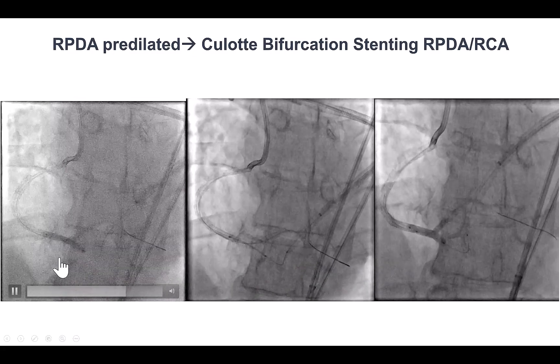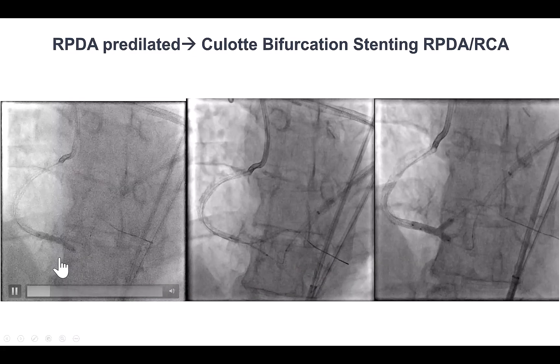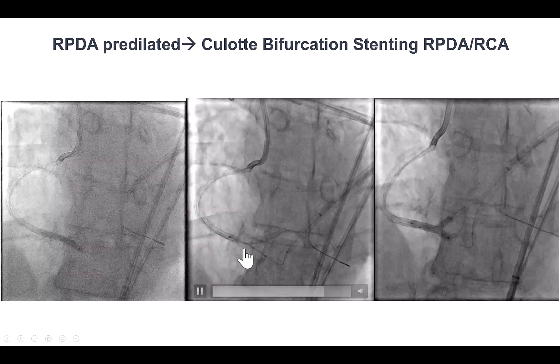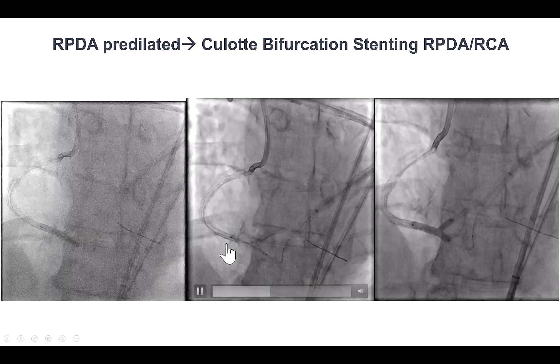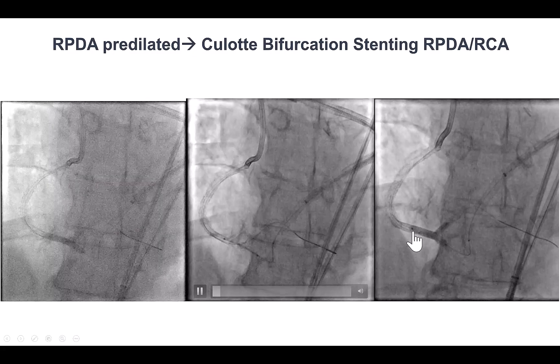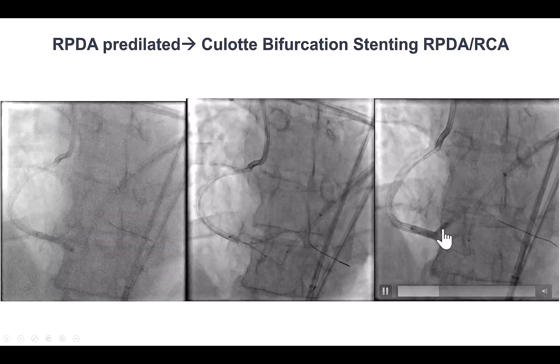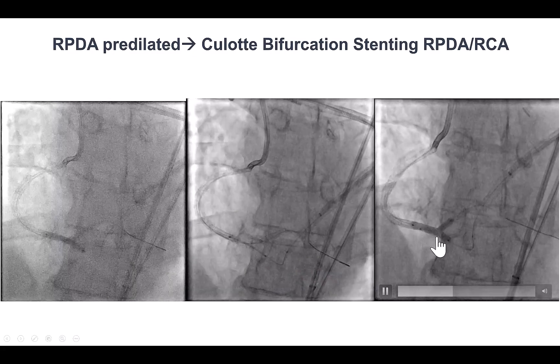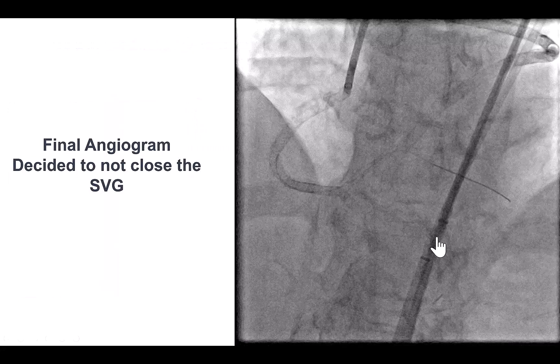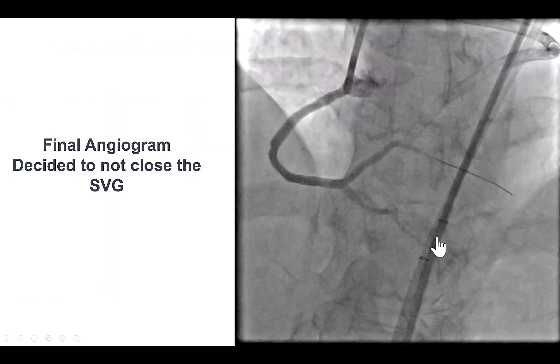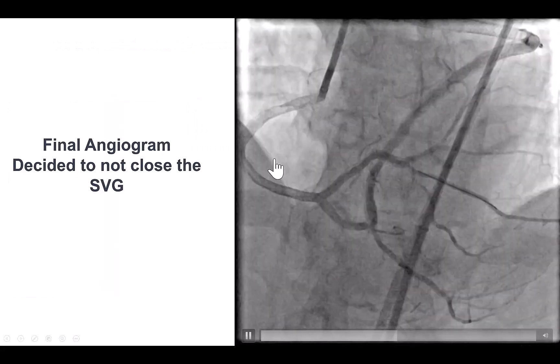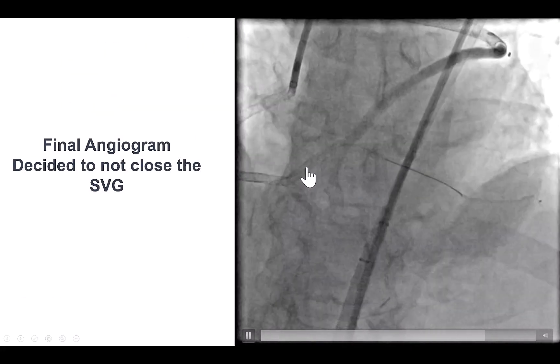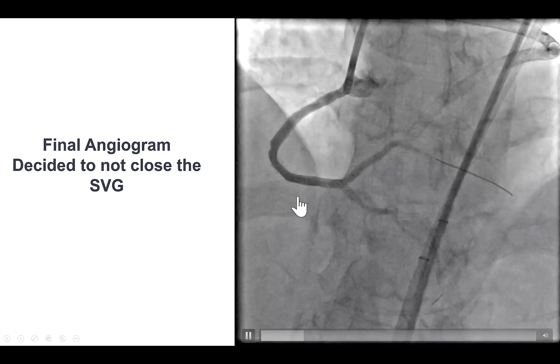We knew we had the PK papyrus, so we wanted to put a second stent. A stent was placed from the distal RCA into the PDA, followed by kissing balloon inflation. The final result showed good flow both into the posterolateral and the PDA.